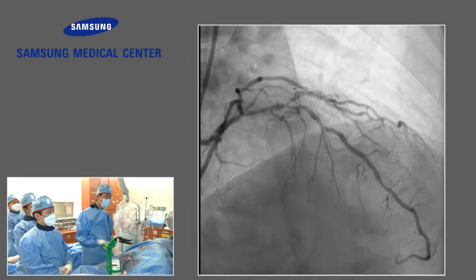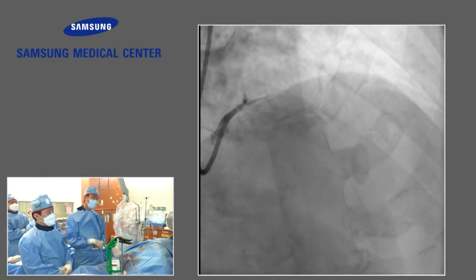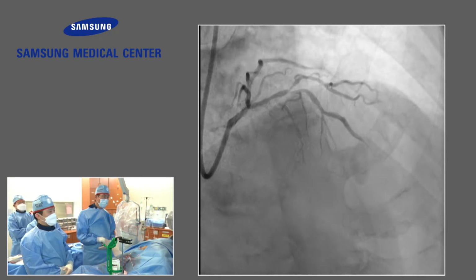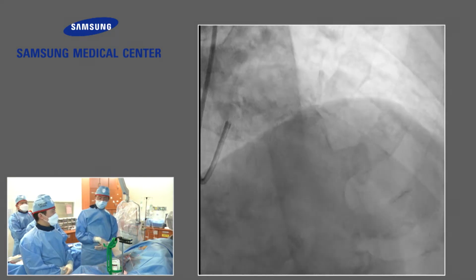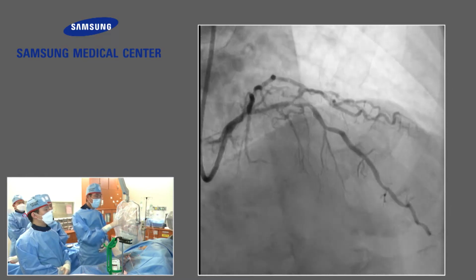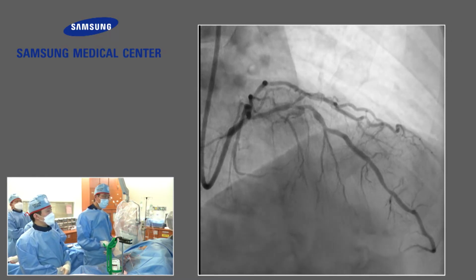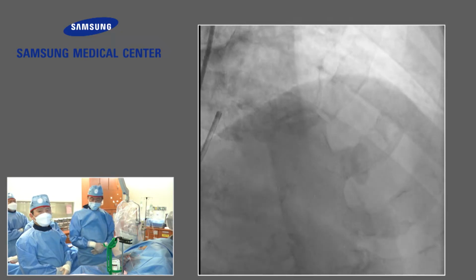Another interesting one is just the distal mid-LAD, at the septal branch, where you can see about 40% stenosis. It's a little bit flexing. So maybe the stent can be extended above this lesion. IVUS, please.